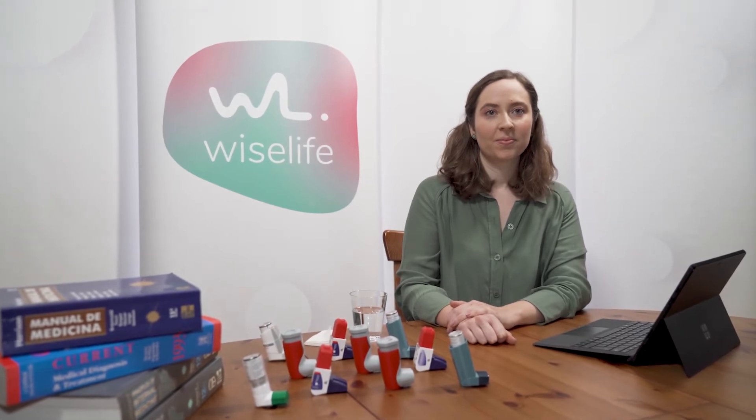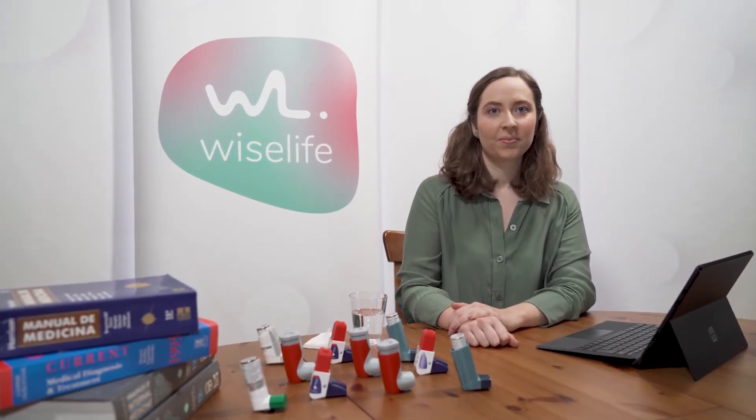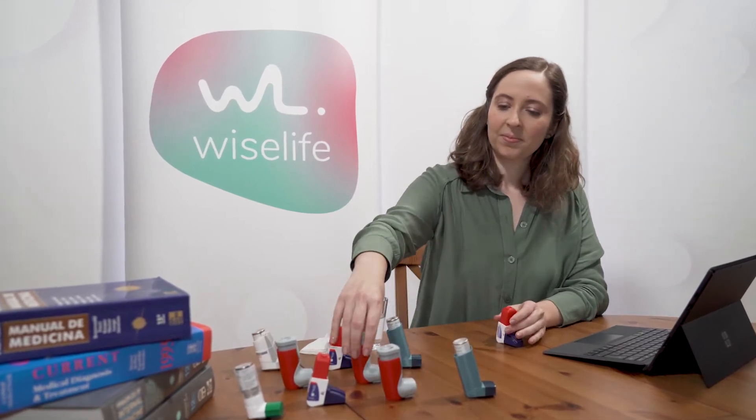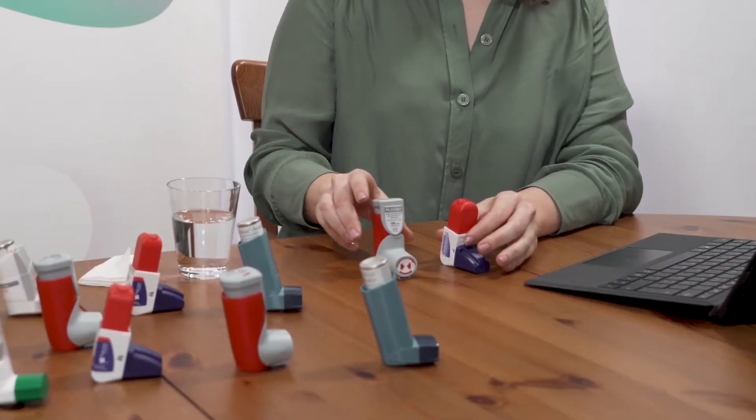Welcome to another WiseLife video. Today we are going to demonstrate the use of pressurized inhalation devices. There are several devices, but the inhalation technique is common to all of them.